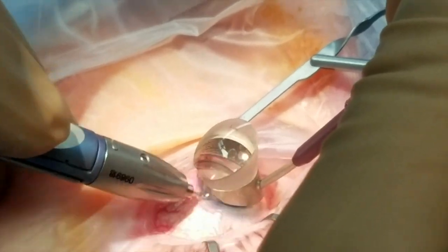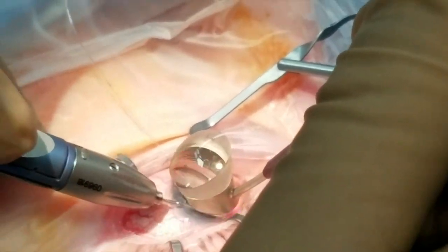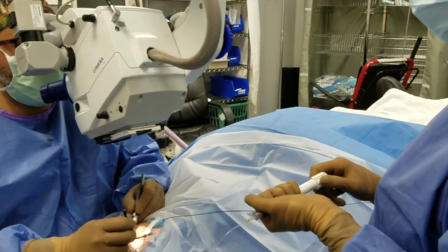You can see the lit tip coming around 360 degrees, letting you know where it's at all times. Here you can see that it's come all the way around 360 degrees. The lit tip again shows you where you're at. All right, I think at this point we're getting ready to go.